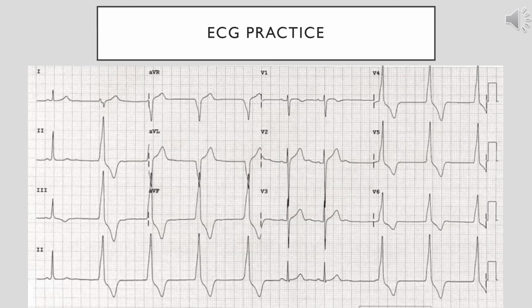But what's interesting is that we go from this junctional rhythm to a few atrial beats. Looking at the atrial beat, we have the PR interval within one big square, so we know that we don't have a first degree block, so that's good. But that rate is just a little bit over 60 beats per minute. So it's a slow heart rate until we get to where that atrium doesn't fire off another beat.